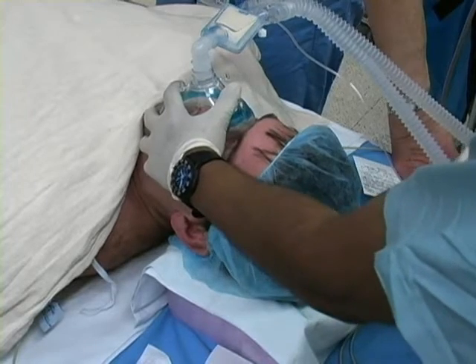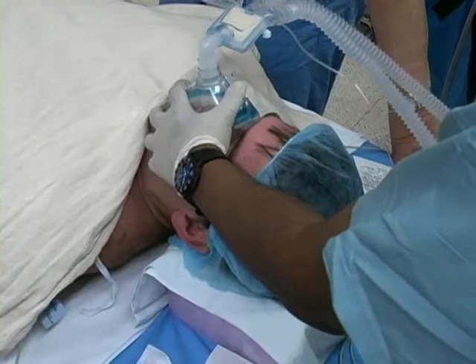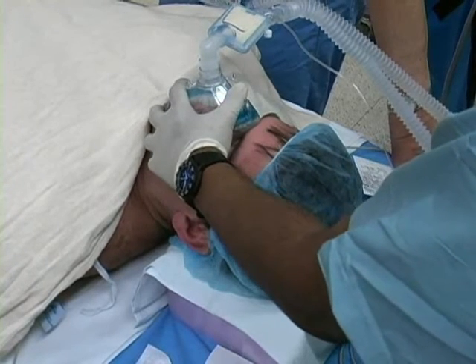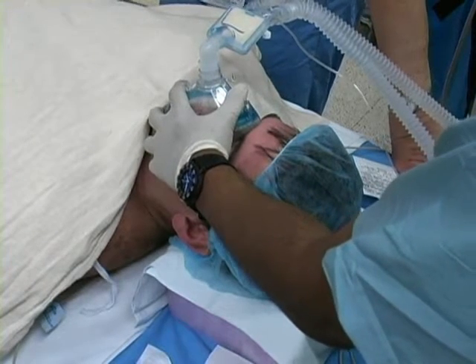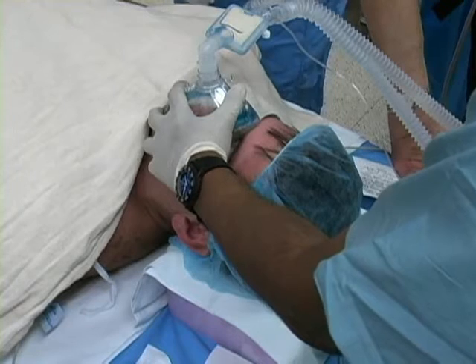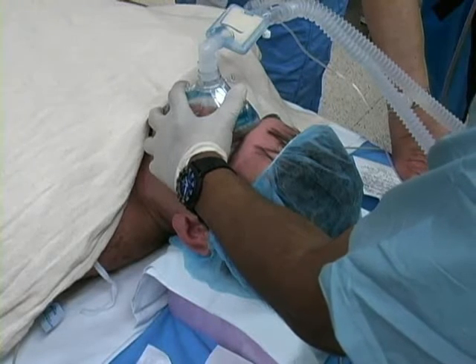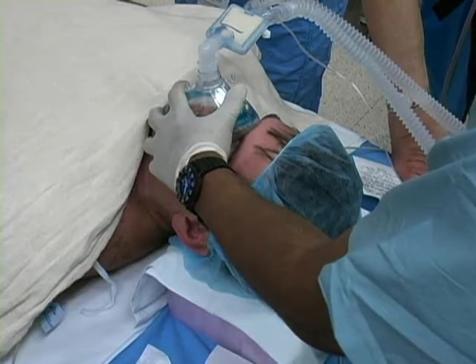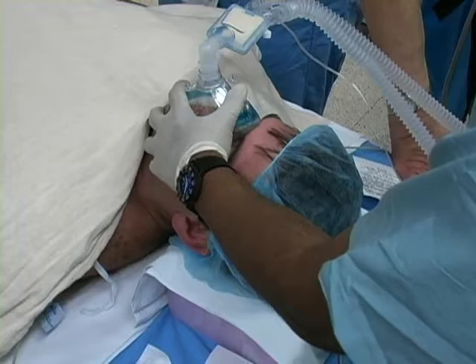Induction of anesthesia is initiated while the patient breathes 100% oxygen. After ensuring that the patient can be successfully ventilated using a mask, you may proceed with laryngoscopy.